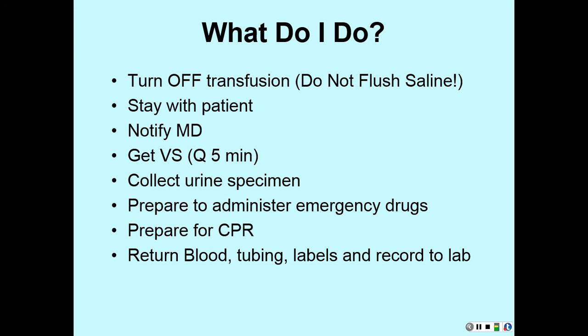Most of your blood products come from the lab and the blood bank. So if you're giving albumin and those kind of things, all that stuff is going to come from the lab. They require specialized tubings, so they'll either give you the tubing or it'll be available on your units. But platelets take an extra kind of tubing.